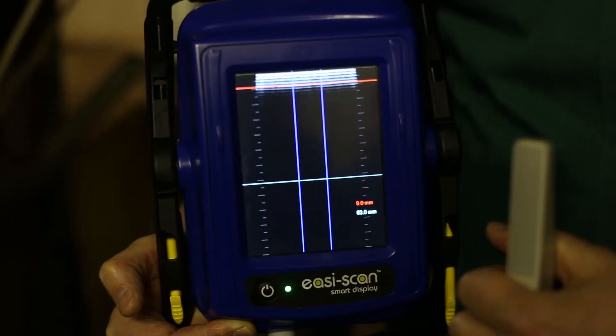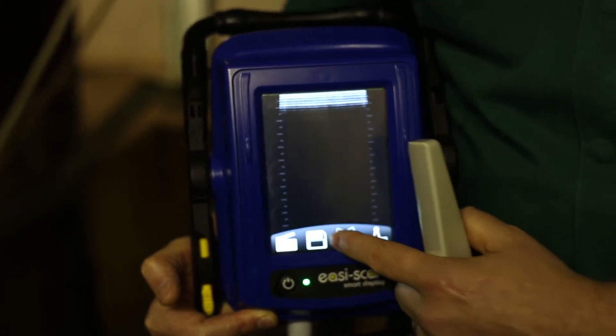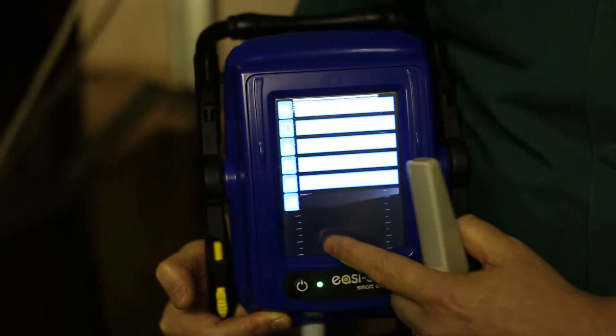Once we have the image that we would like to achieve, we then press the freeze button, tap the screen, and press the save function.